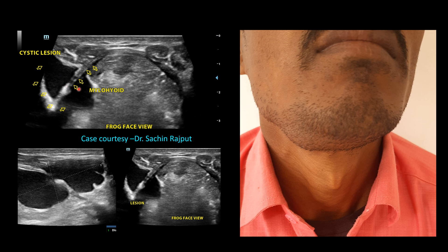This is the submandibular space, this is the sublingual space, this is the mylohyoid muscle, and this is the typical frog face view. There is a cystic lesion extending from the submandibular space into the sublingual space, with a small breach or defect noted in the mylohyoid muscle. The cystic lesion passes through this defect and is bilocular with a few internal echoes.